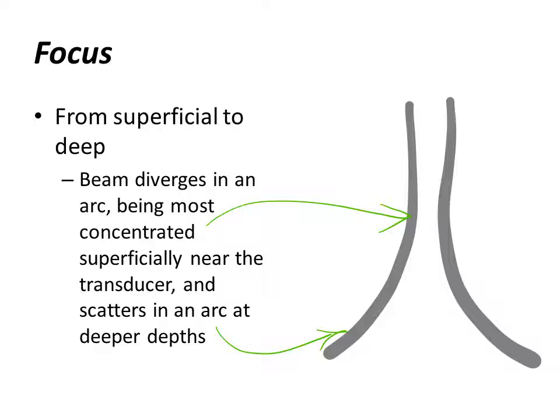So if you want a particular structure to be seen the best, what you can do is manipulate the position of the focus.